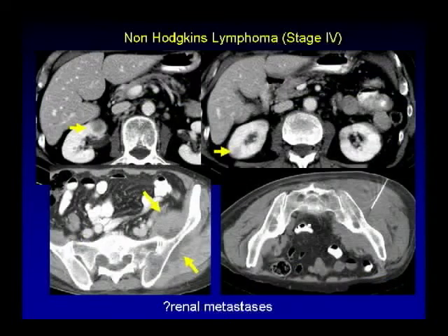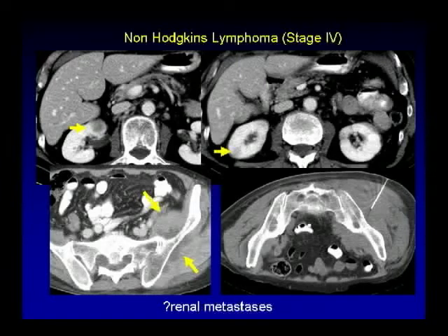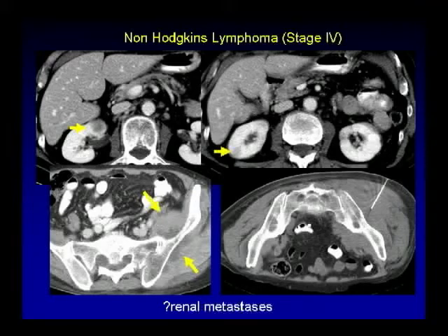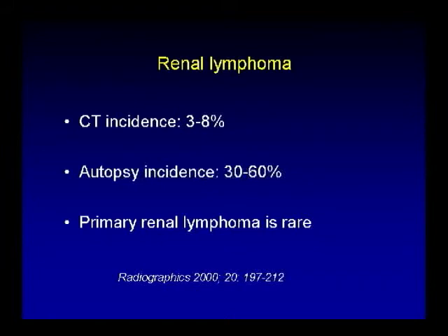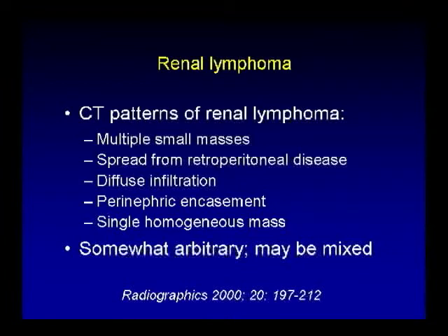Another case with multiple ill-defined masses in the right kidney and a large solid mass centered around the left iliac. Is this RCC with metastatic disease, another primary malignancy with renal metastasis, or lymphoma? This mass was biopsied and turns out to be non-Hodgkin's lymphoma. Renal lymphoma has a CT incidence of 3 to 8 percent with a much higher autopsy incidence. Primary renal lymphoma is rare. CT patterns include multiple small masses, spread from retroperitoneal disease, diffuse infiltration, perinephric encasement, or a single homogeneous mass.